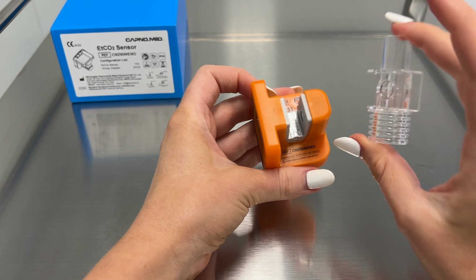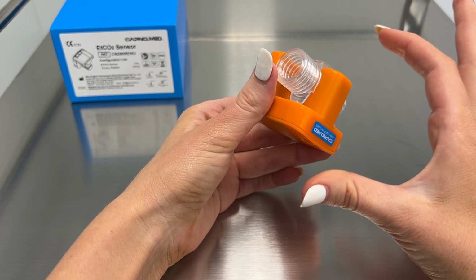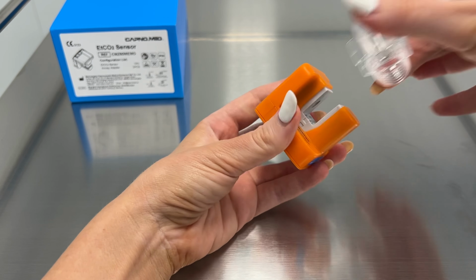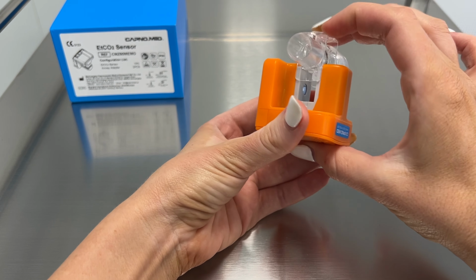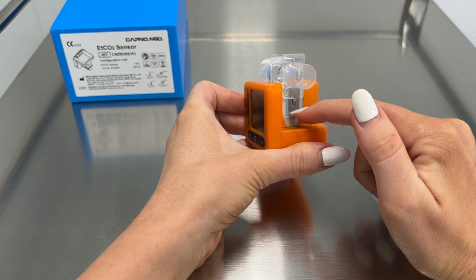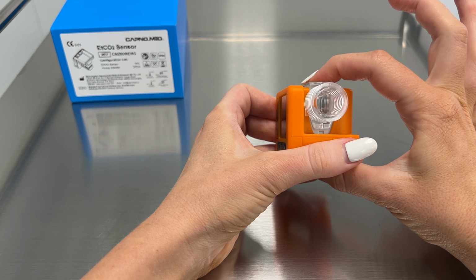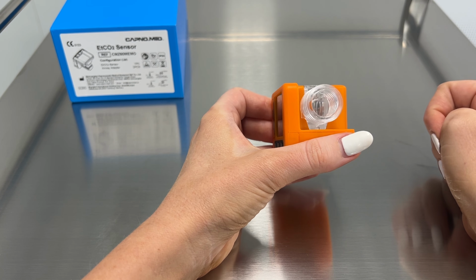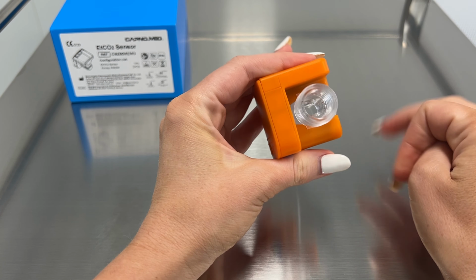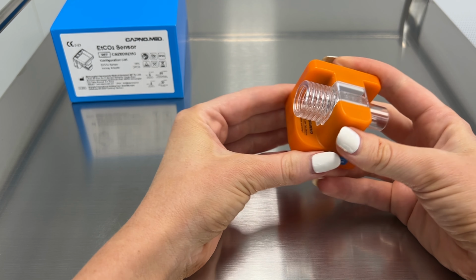And now I can attach my adapter into the sensor. This will have to go a certain way. It might be a little bit tricky, but it will not fit in if you've inserted it the wrong way. So say for example I had placed it in this way. It's not going any further than that, but it needs to sit down nice and snug in here. So all I'm going to do is pick it up, twist it around, and it's sliding in nicely like that and clipping right into place. So it's nice and snug in there, it's not going to fall out at all. One side would attach to your breathing tube and one side would attach to your endotracheal tube.